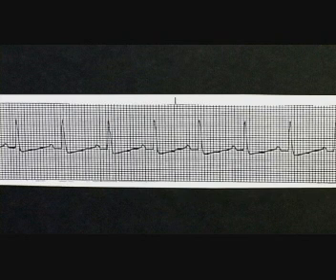Now determine if a P wave precedes every QRS, if they look alike in shape, and if they appear at regular intervals. Then, measure the PR interval to see if impulses are conducted through the AV node at a normal rate, which is 0.12 to 0.20 seconds.